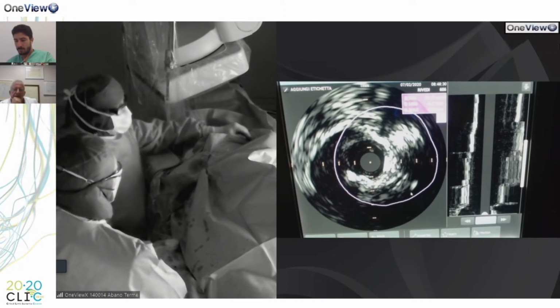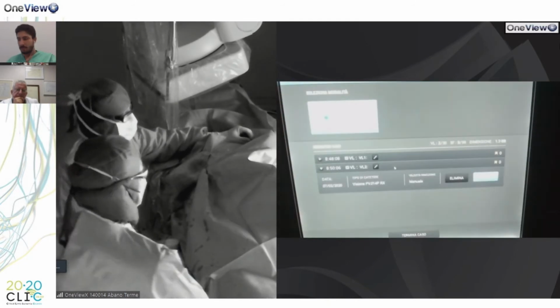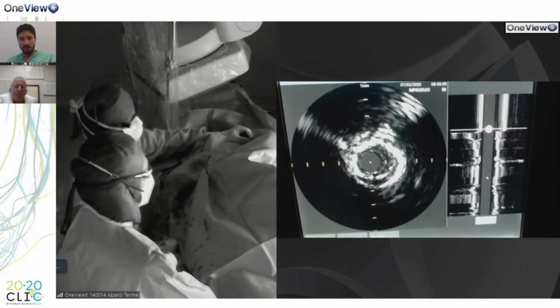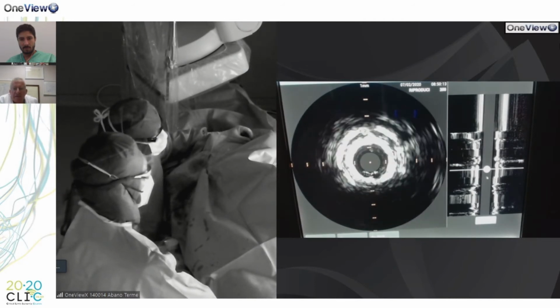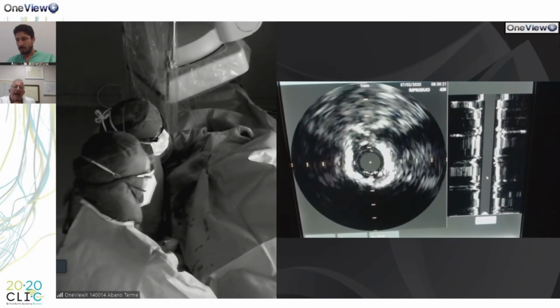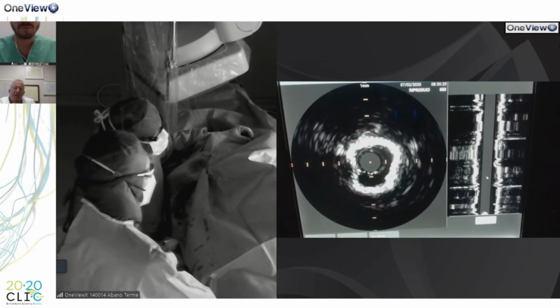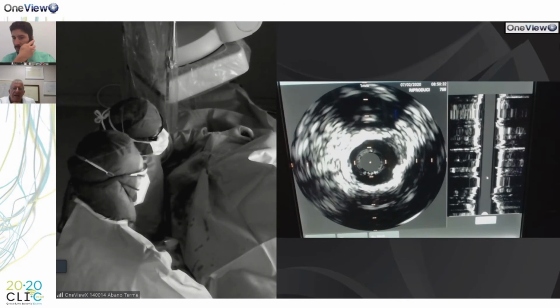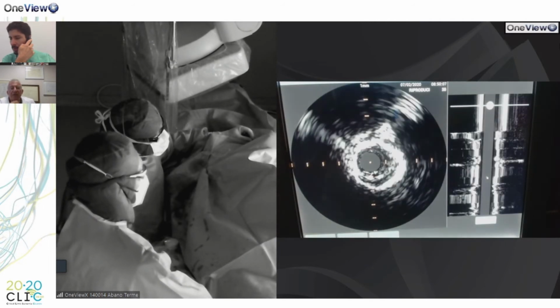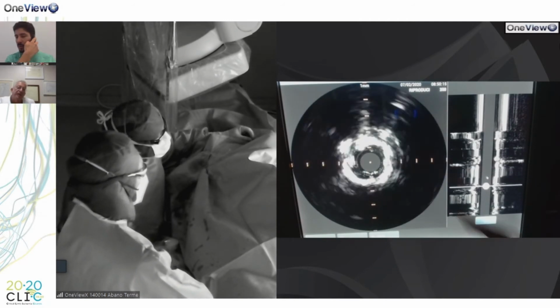So yes. And can we see the imaging of the tibial artery so we can start with the atherectomy in the tibial, because we have to recanalize the tibial. You can see this is the anterior. Yeah, and I imagine that the IVUS was like this because it was more difficult to pass through the lesion in the anterior tibial. So it's regular, and in this case, you could use, I think, a scoring balloon, maybe, if you have a scoring balloon, to reduce the calcium plaque.